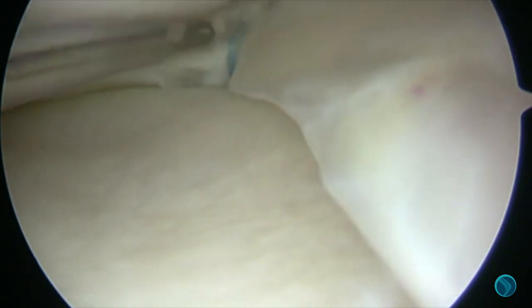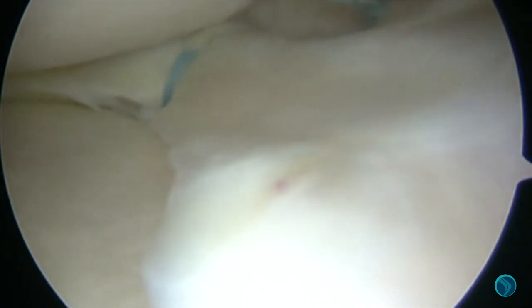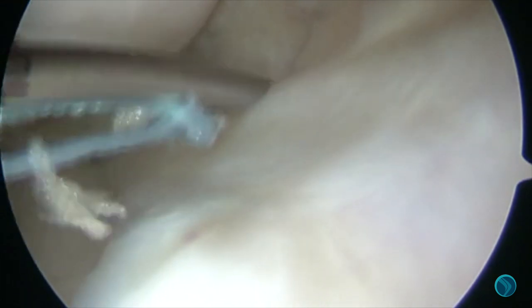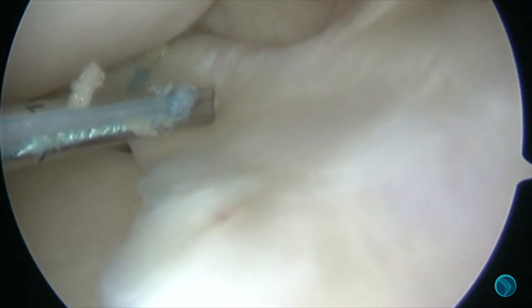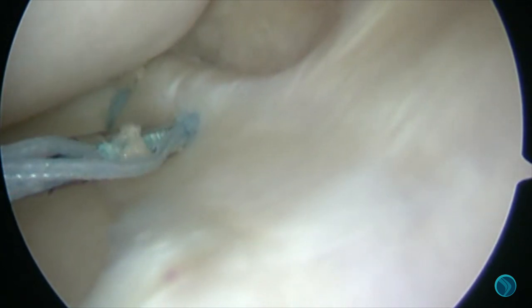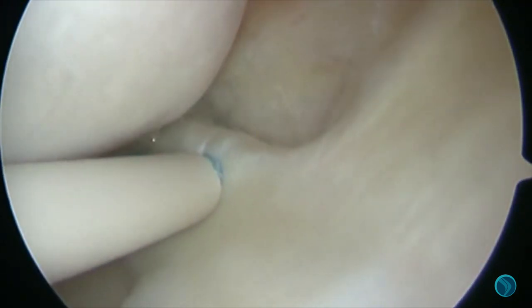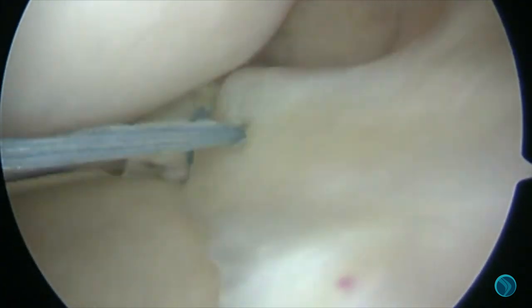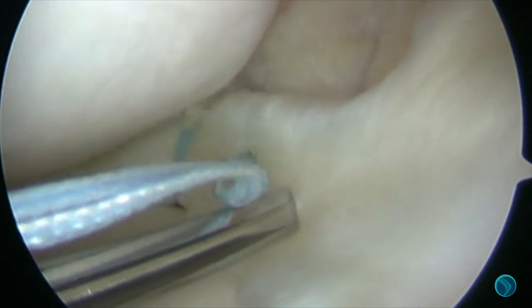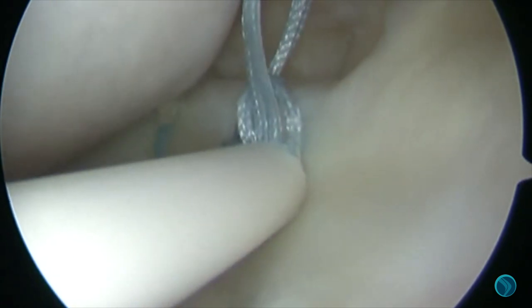This was a very unstable meniscus and needed multiple sutures. Using the skid in the pack just to protect the articular cartilage, we brought in the second fibre stitch. This one we decided to do in a slightly different manner, doing a horizontal mattress type suture. You can see with the needle the first device loaded and ready to go — going through the meniscal tissue, then through into the capsule, advancing the first fibre stitch into the posterior capsule, and bringing the needle back into the joint. Then moving along in a horizontal fashion, again penetrating the meniscus then the capsule, and advancing the second fibre stitch into the capsule of the joint.